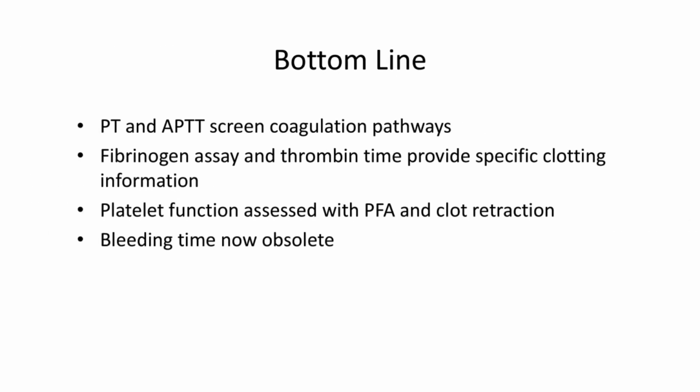In summary, PT and aPTT screen extrinsic, intrinsic, and common pathways. Specialized tests, such as fibrinogen assay and thrombin time, further evaluate clotting. Platelet function is assessed with PFA and clot retraction, with bleeding time now largely obsolete.